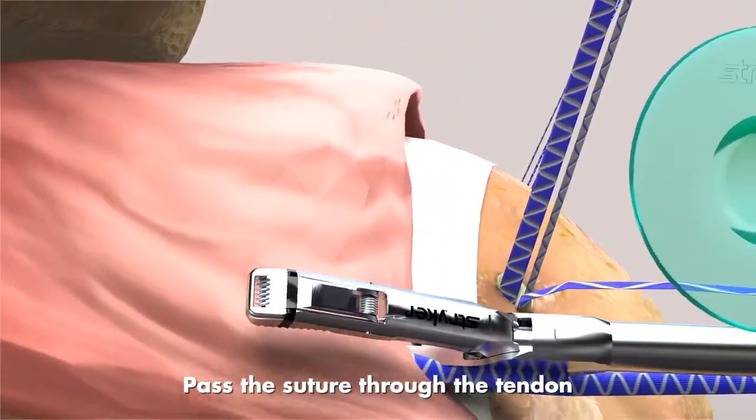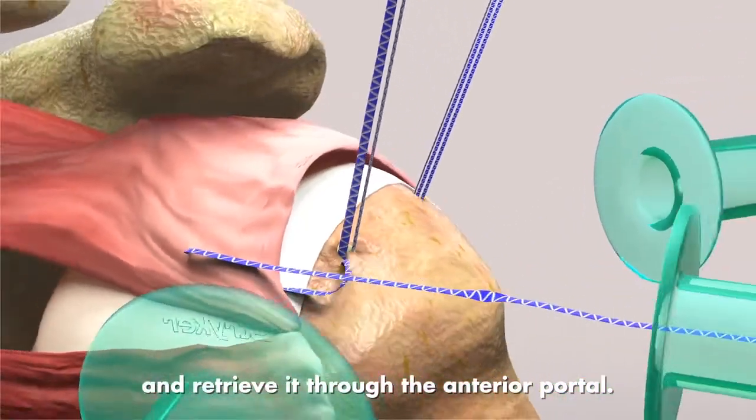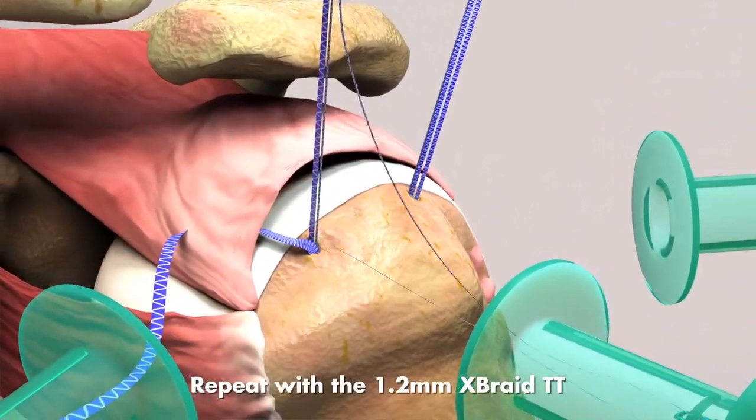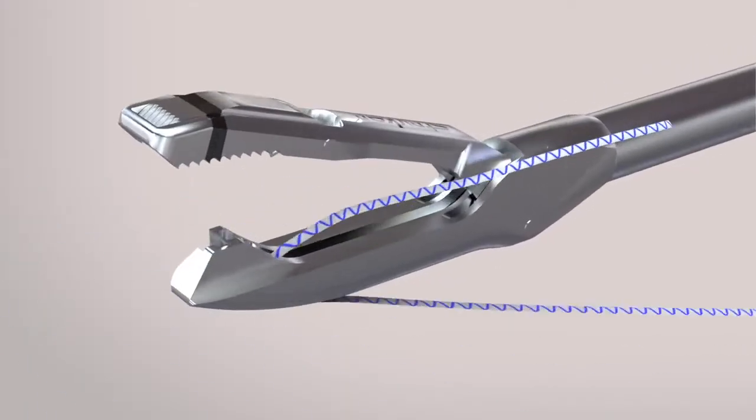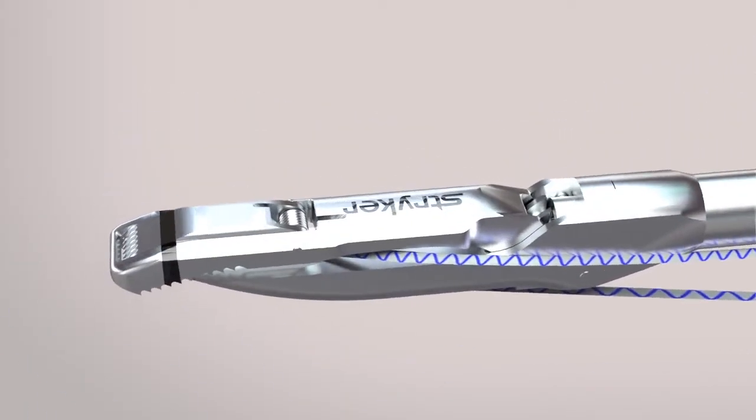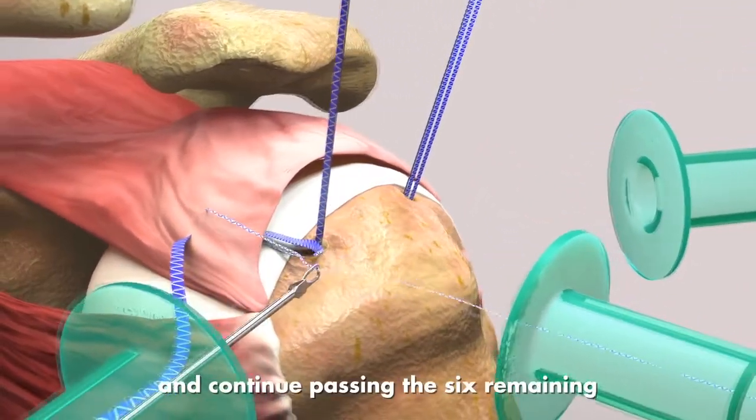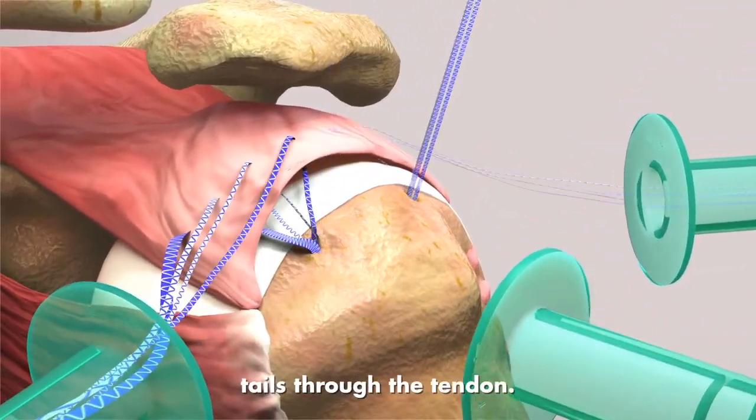Pass the suture through the tendon and retrieve it through the anterior portal. Repeat with the 1.2mm X-Braid TT and continue passing the six remaining tails through the tendon.